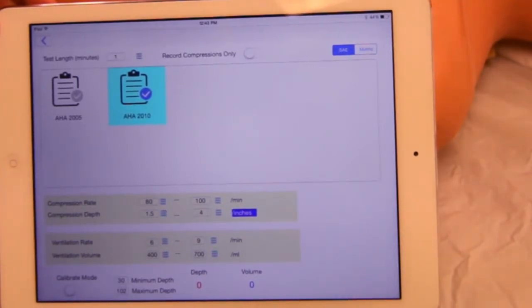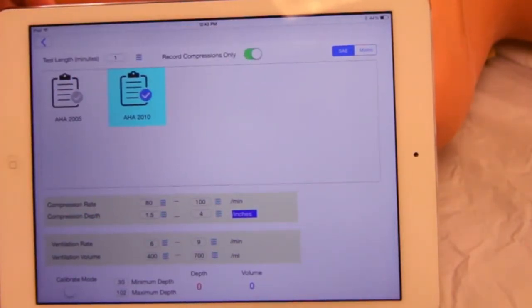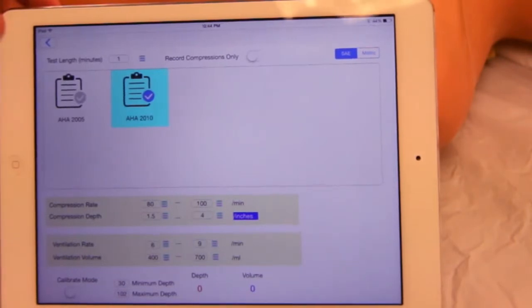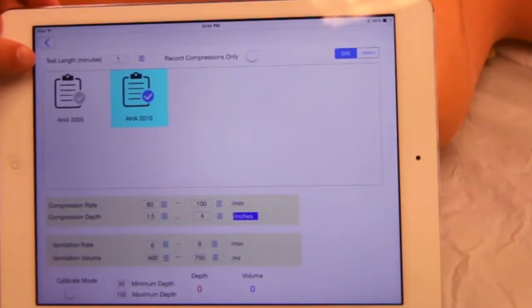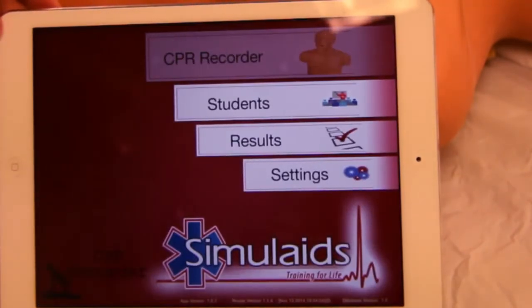You can select to test only compressions, or compressions and ventilations. You can also set the length of time to test.